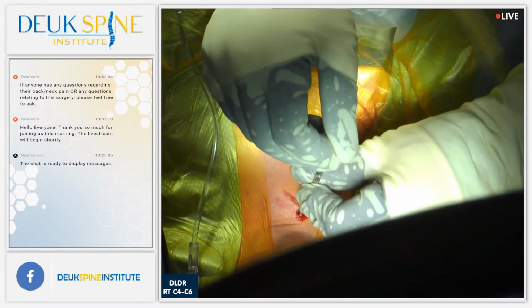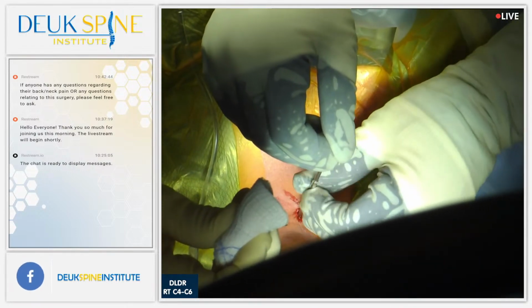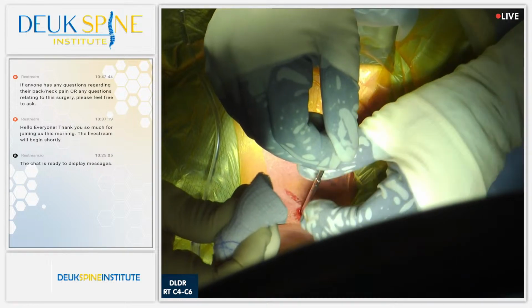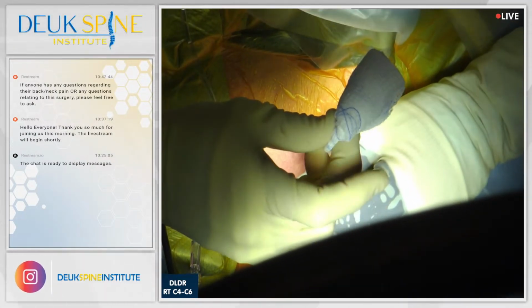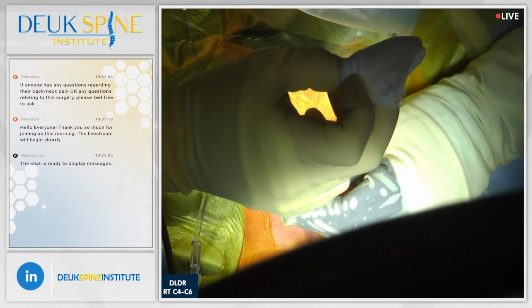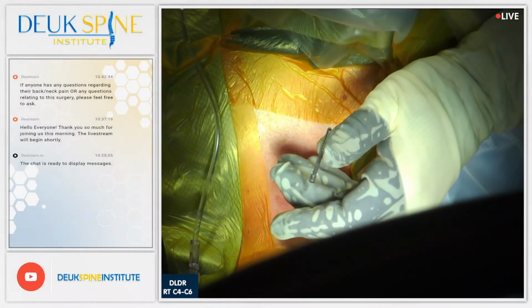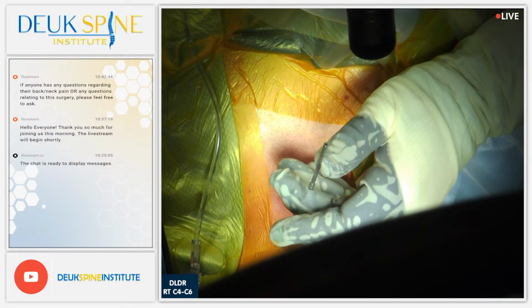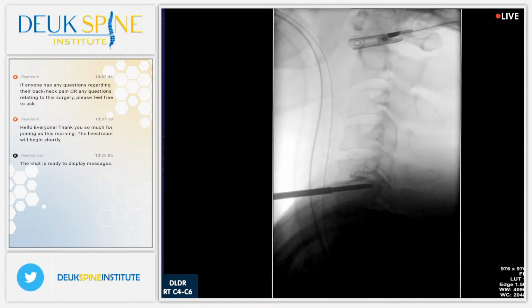People ask me, well, don't you make a hole in the front of the disc? We do not. We actually push through the fibers, and the fibers spread apart. The disc is fibrous. Fibrous means it's like the clothing you're wearing, okay? Let me just see if I can advance it. All right, so think about your cotton shirt. If you were to put a pin in your shirt, like a little safety pin, it's not cutting a hole in your shirt, it's spreading your cotton fibers apart.